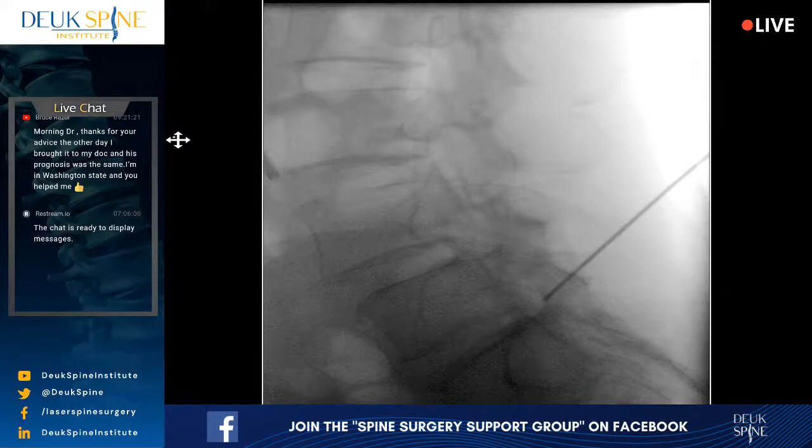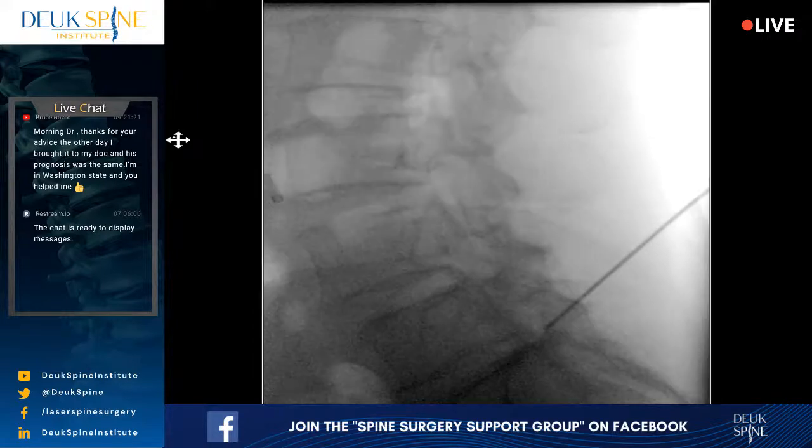I just want to be 1,000% sure of where we are. It's kind of hard to tell with the scoliosis. I think we're going to end up coming right back here, but let's just WAG a degree north, see if it makes it any better before we go into the foramen. I feel like that's a little better with the pedicle at least. I'm happy with that. You okay? All right. You're doing great, by the way.